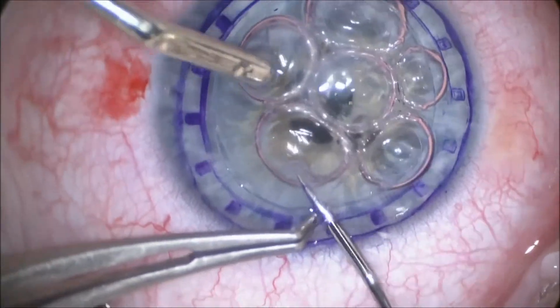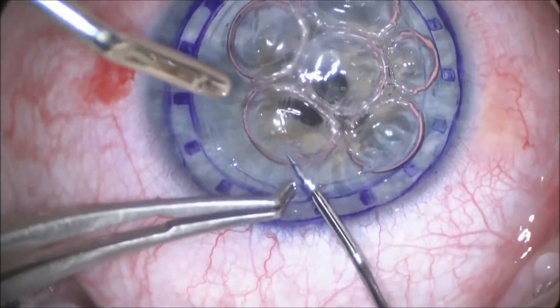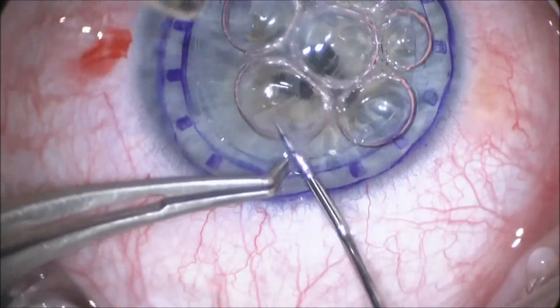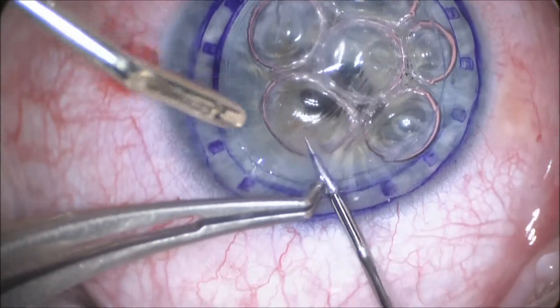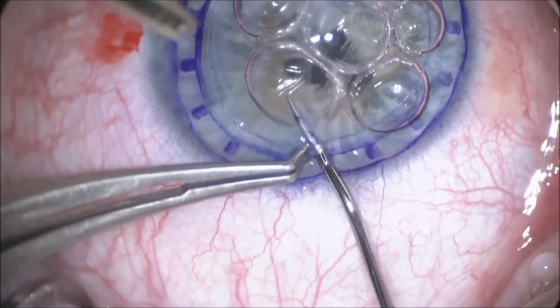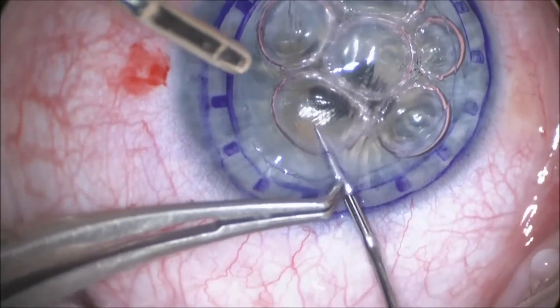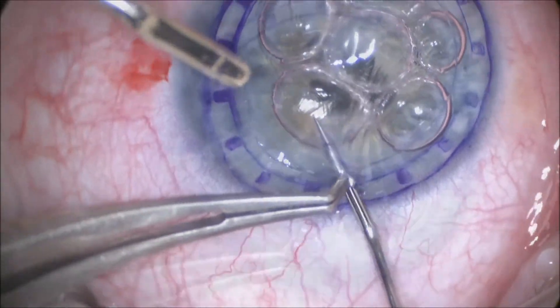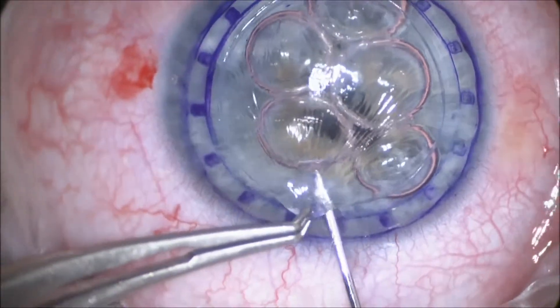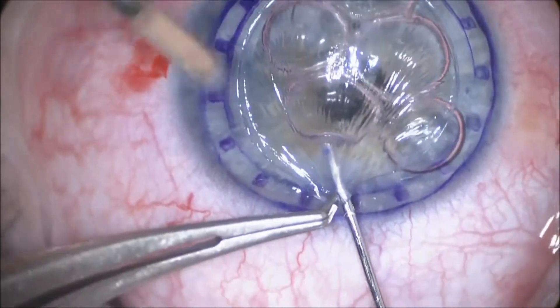This step is particularly important. It's important to be zoomed in and it's important to actually see the folds on Descemet's membrane or the posterior stroma as you advance the needle.